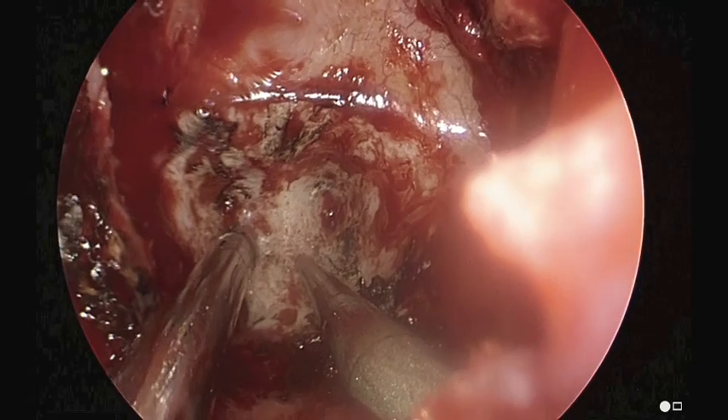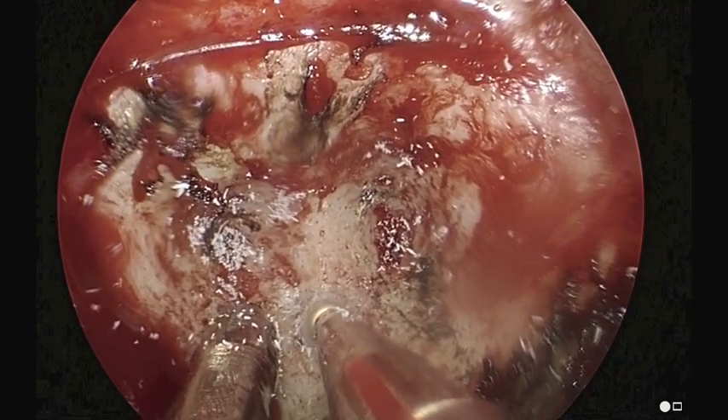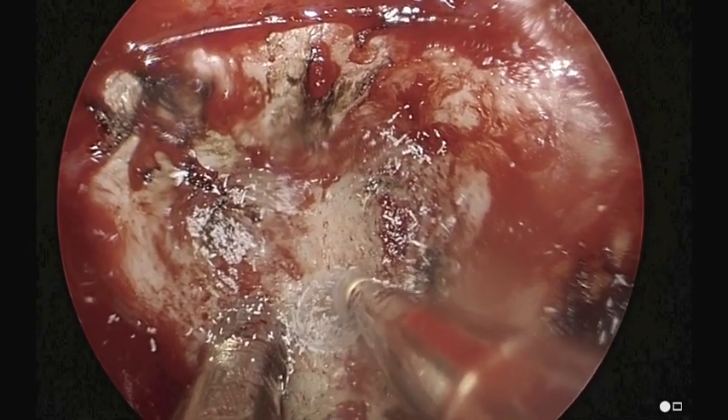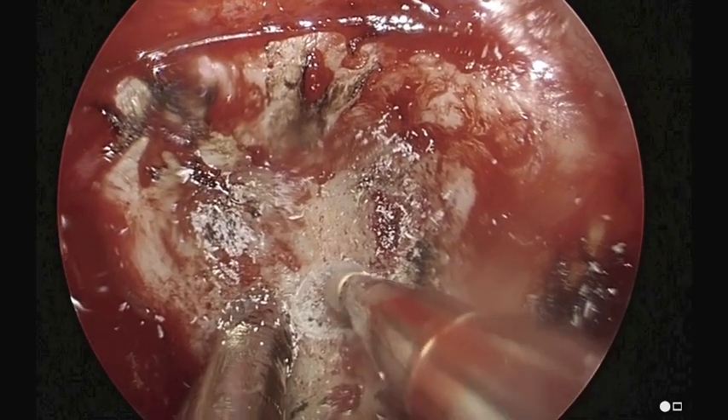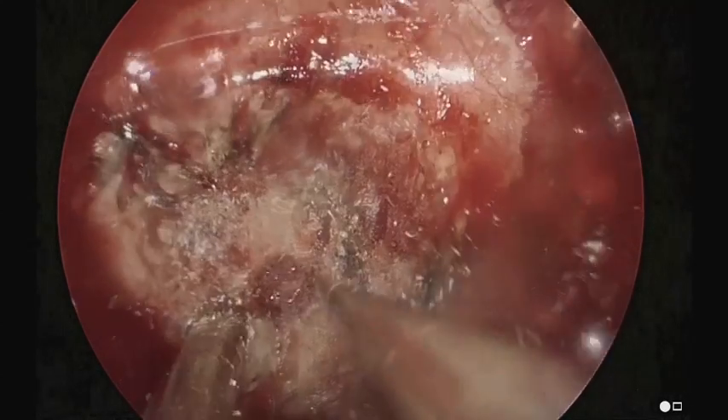This is image guidance. As we start our drilling on the clivus, we're starting in the mid portion and we're going to move to the patient's left side, which is on the right of the screen, which is where the lesion is. That's going to be just medial to the carotid artery.